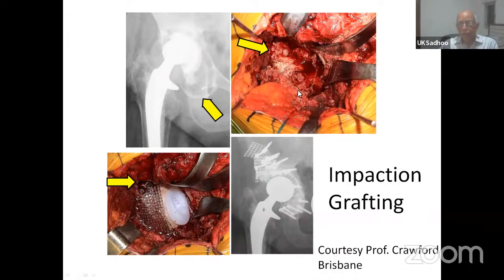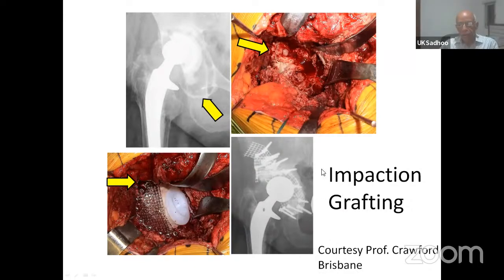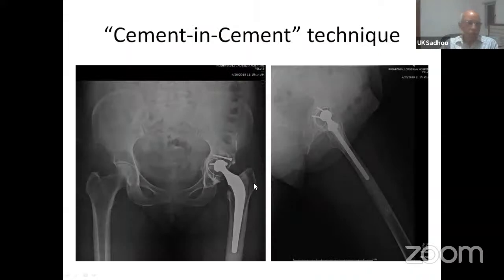This is a little more tricky. This is courtesy of Professor Crawford from Brisbane. Here you see the massive osteolysis, the proximalization and the medialization of the cup, the great lucency. But those people are very good with the so-called impaction grafting, and you see the cup has been put back into its required position, not a high hip center. The bed has been prepared with impaction grafting and the poly cup has been cemented into the newly minted acetabulum bed.